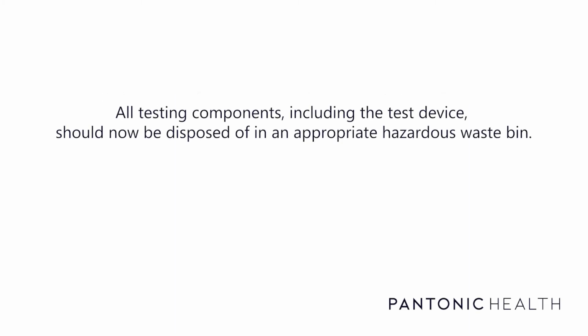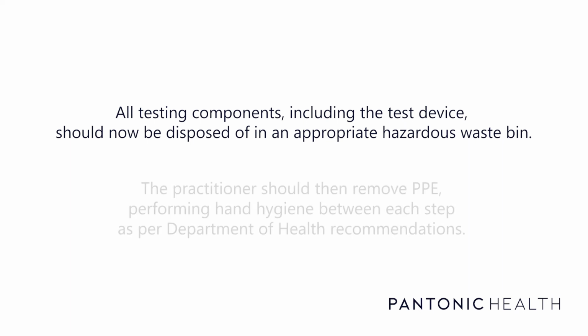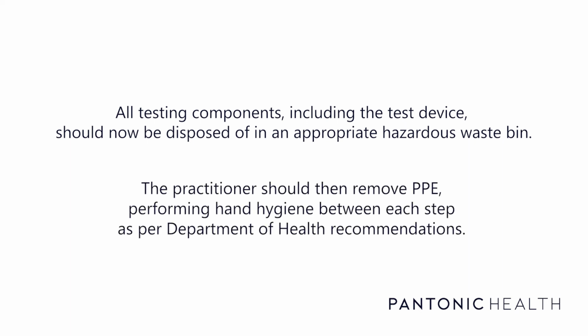All testing components, including the test device, should now be disposed of in an appropriate hazardous waste bin. The practitioner should then remove PPE, performing hand hygiene between each step, as per Department of Health recommendations.